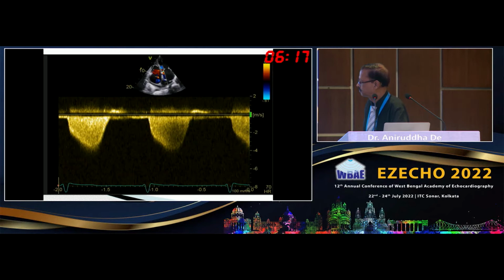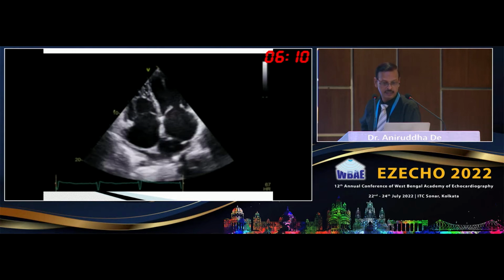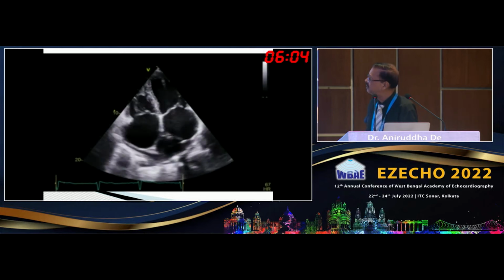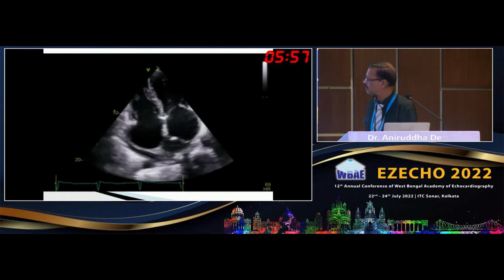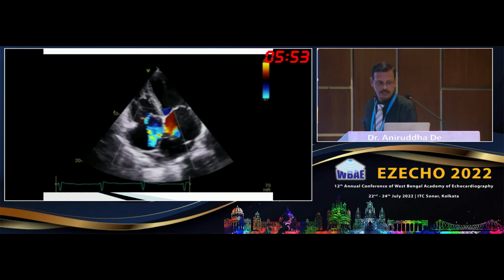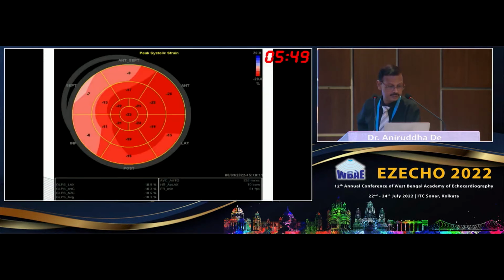The tricuspid valve is not normal. It is also slightly thicker. There is some degeneration, but not like the mitral one. Maybe slight thickening of the tricuspid valve is there, and there is no gradient across it. There is also a pericardial effusion. The patient is in some decompensated stage, with pulmonary edema, and the GLS is somehow maintained in this patient.